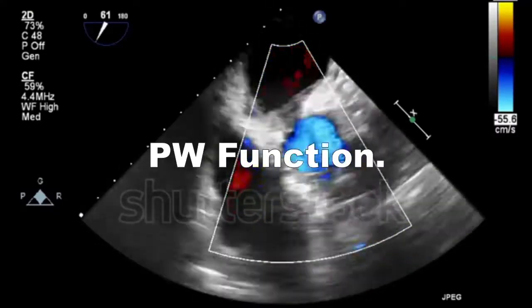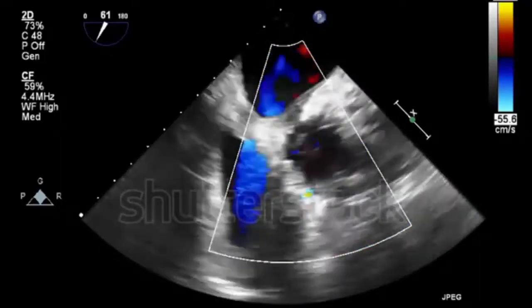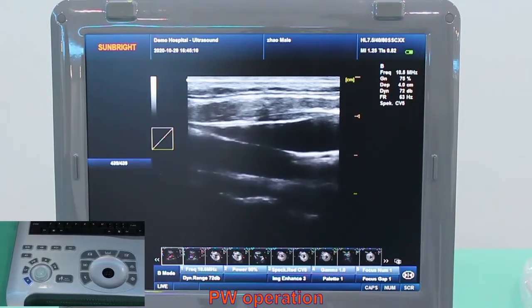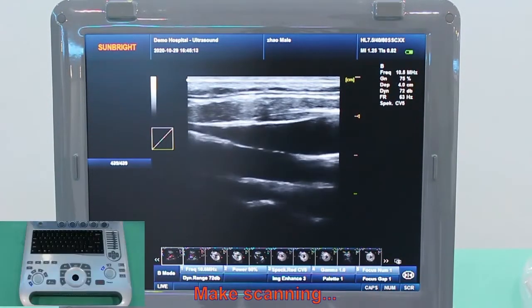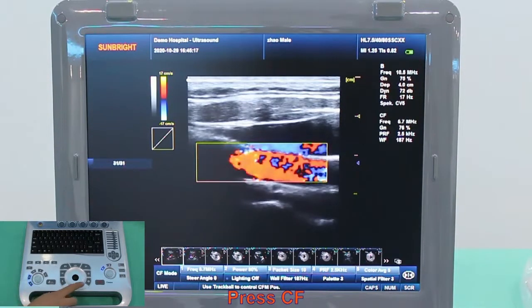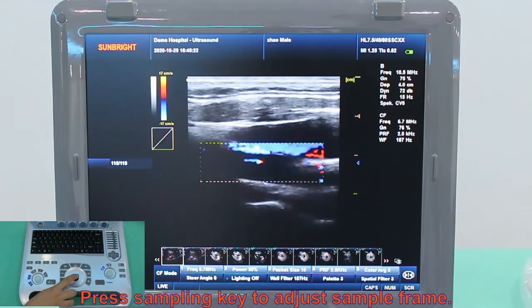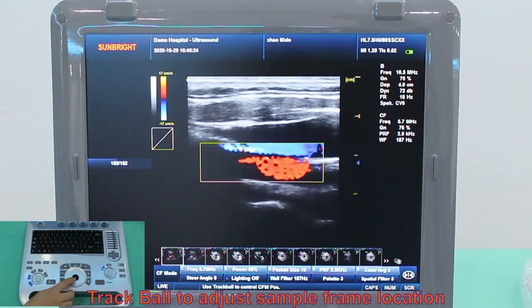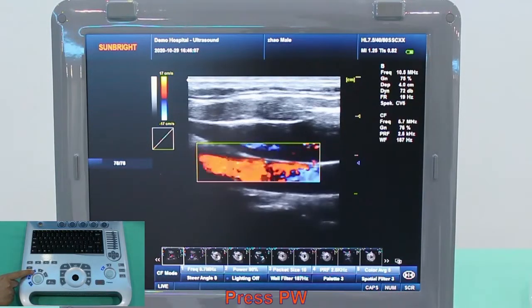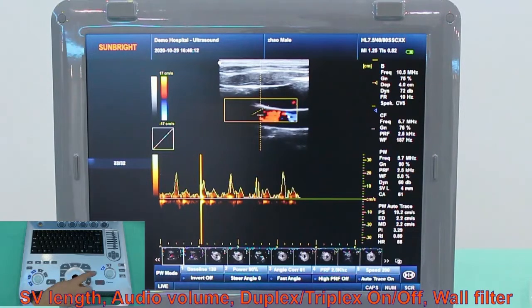PW function: How to use the PW function. Make the scanning, then press CF. You can adjust the size of the sampling frame by pressing the corresponding key. Adjust the location by moving the trackball. Press PW, and you can adjust the SV length.